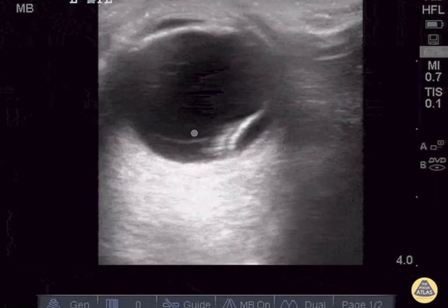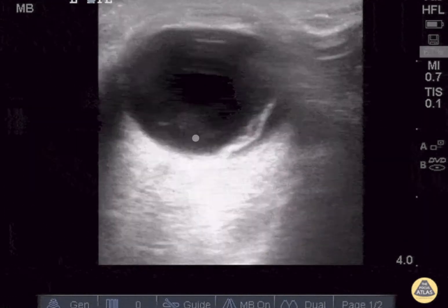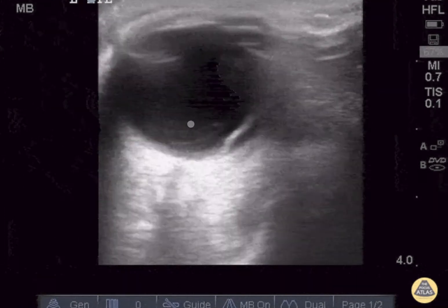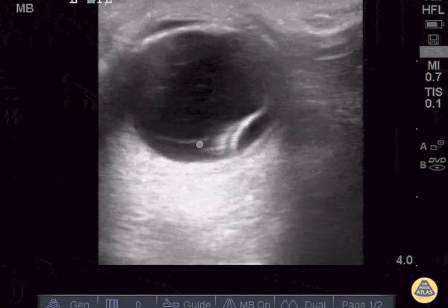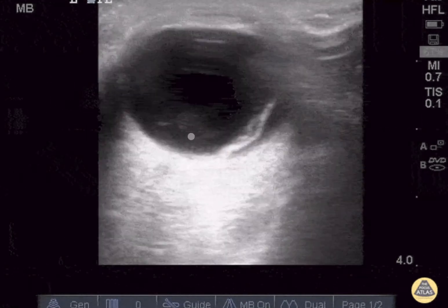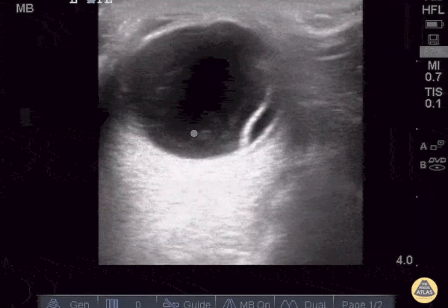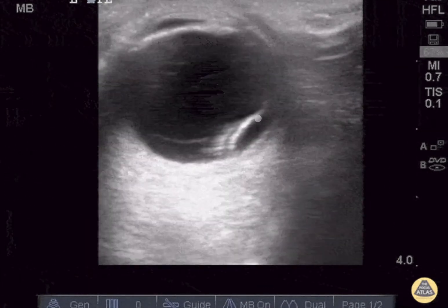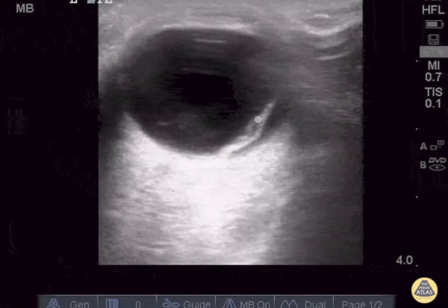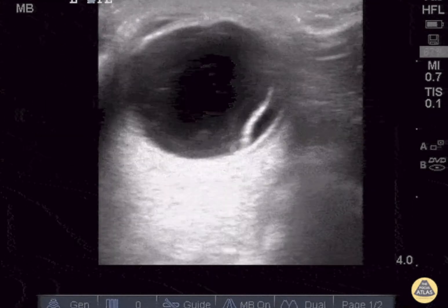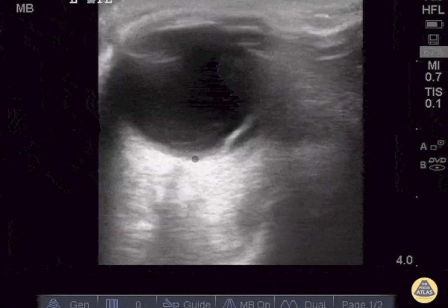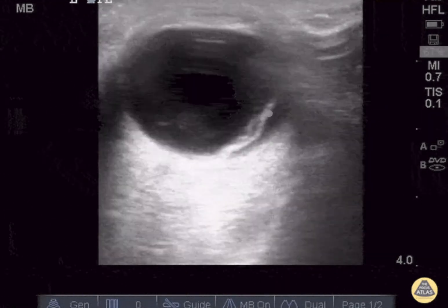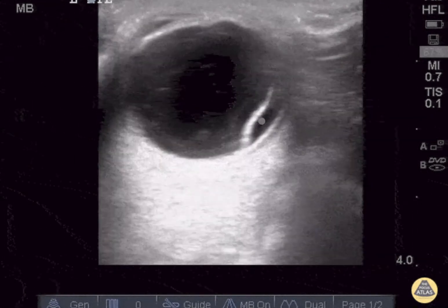The pathology seen here is this thin lacy appearing mobile membrane moving back and forth as the patient moves the eye, which is our vitreous detachment. And this hyperechoic thicker membrane that is seen tethered near the optic nerve is our retinal detachment.